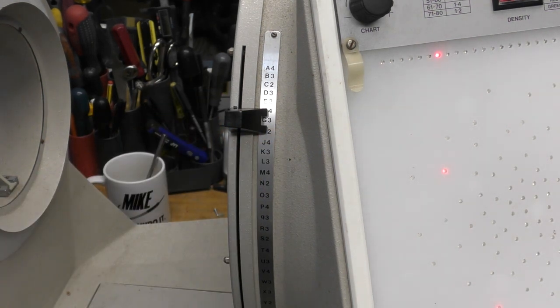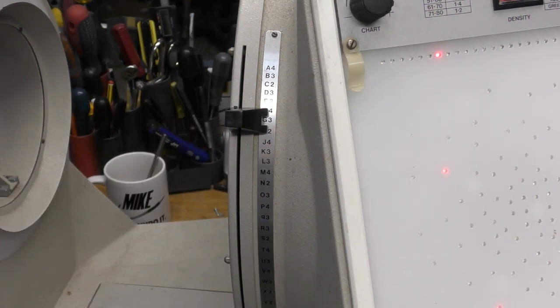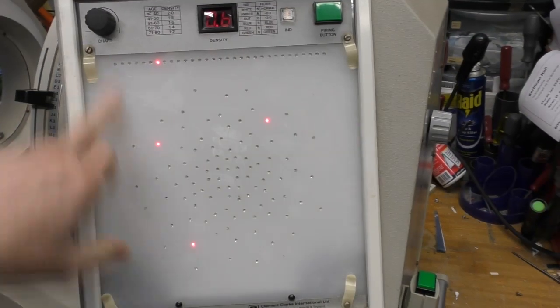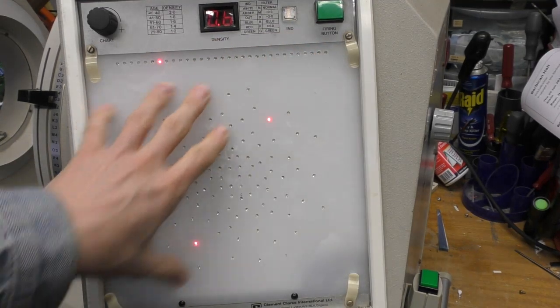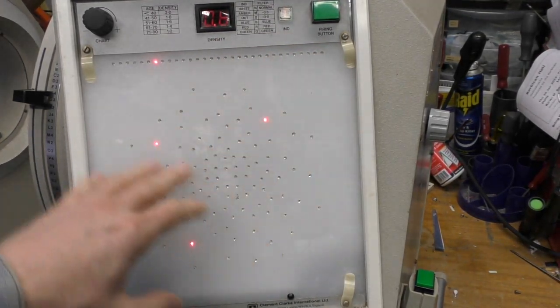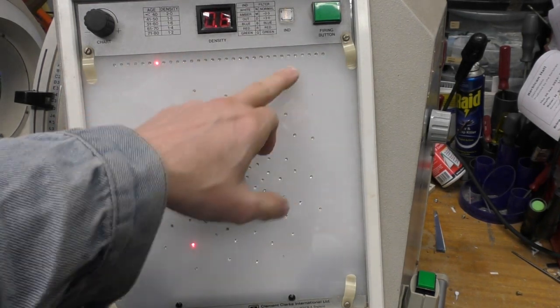I think the normal feedback from the patient is they just tell the person doing the test how many dots they see, and by the permutation of dots and the numbers they can work out which areas of the eye are affected. And there's clips on the front that a chart clips onto here, so that probably gives some more information, and they've got the patient details on there as well as the results for each of the patterns.